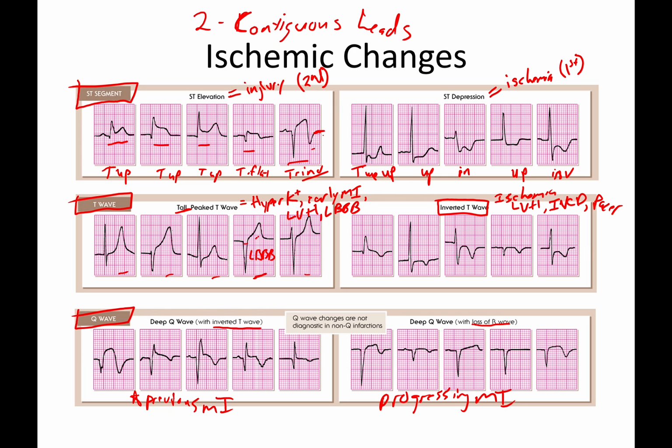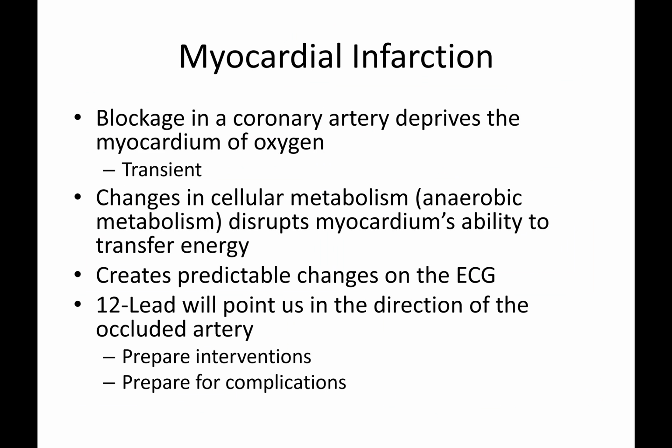It may also be a cardiomyopathy, some hypertrophy could cause this as well, and even COPD, funny enough. But we'll go more into Q waves, I just wanted to give you this rough overview of what these different things represent. All right, myocardial infarction. I'm actually going to stop here, and we'll pick up in a whole other section and walk through MIs and what they represent.